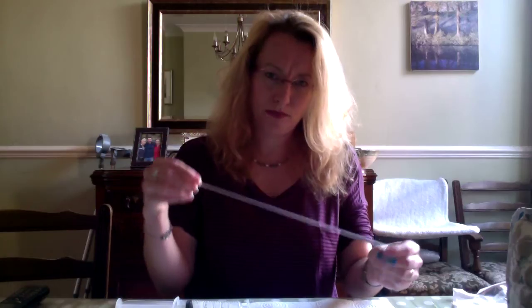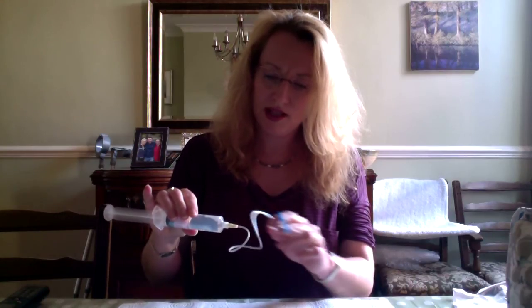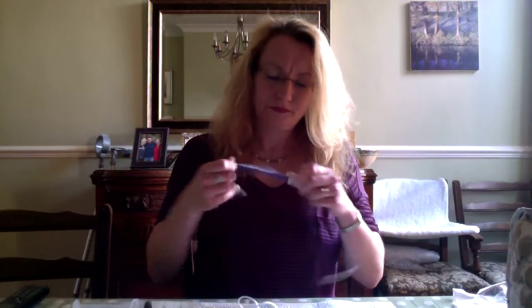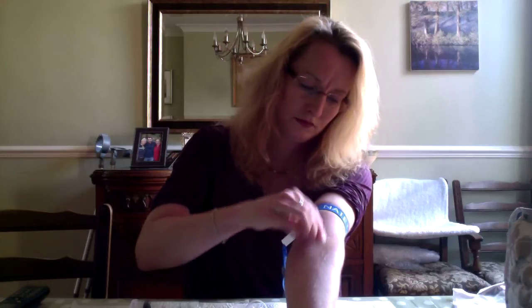Don't know if you'll hear any of this because I don't know if the mic works well, but there we go, we will have a go. This is my needle — bit like a slinky, can't do much about that. So I give it a pull to try and make sure it doesn't ping anywhere, and then fasten that to the syringe. I'll stick the tourniquet on, give it a yank because you want the vein to be as pumped up and easy to access as possible. That's my cotton wool — I've just got that ready for later. So the next thing is to clean the vein, make sure it's all nice and sterile. Give that a good clean.